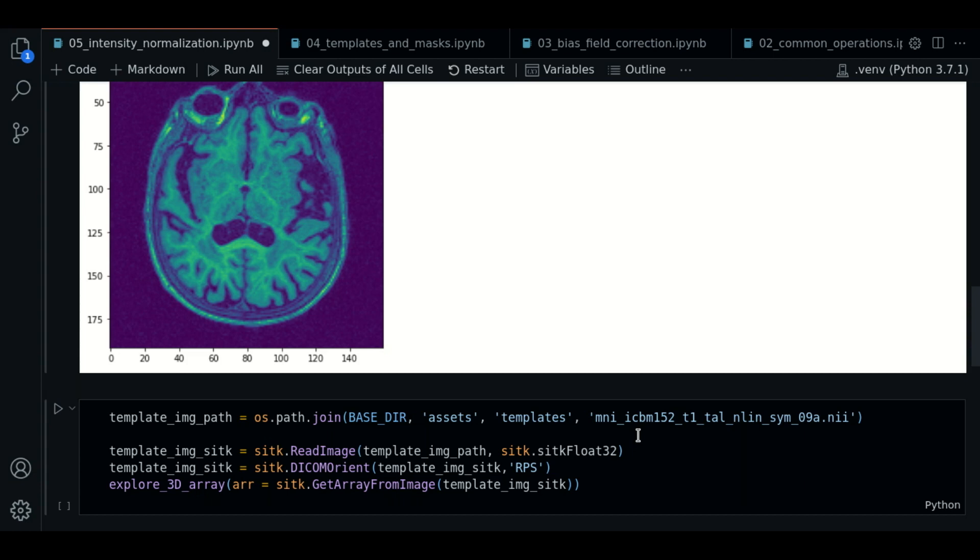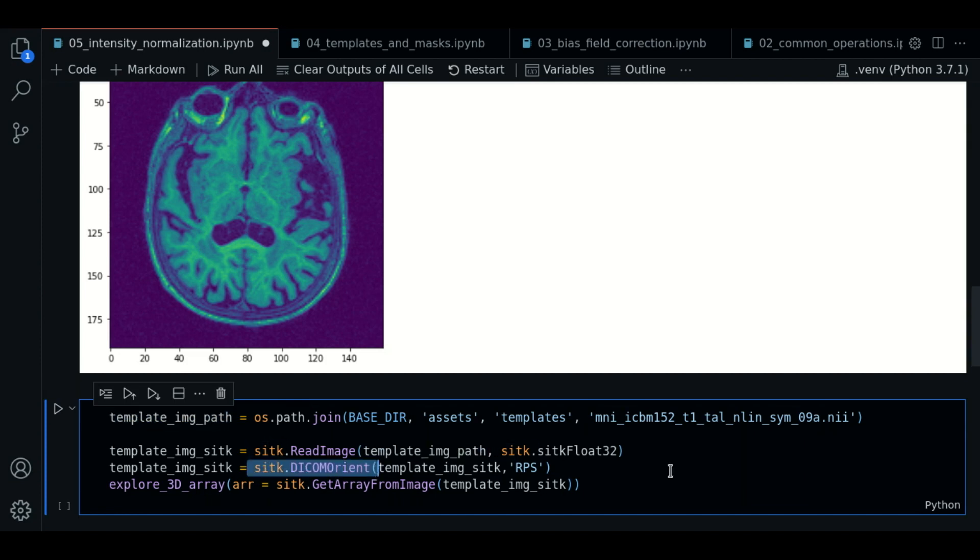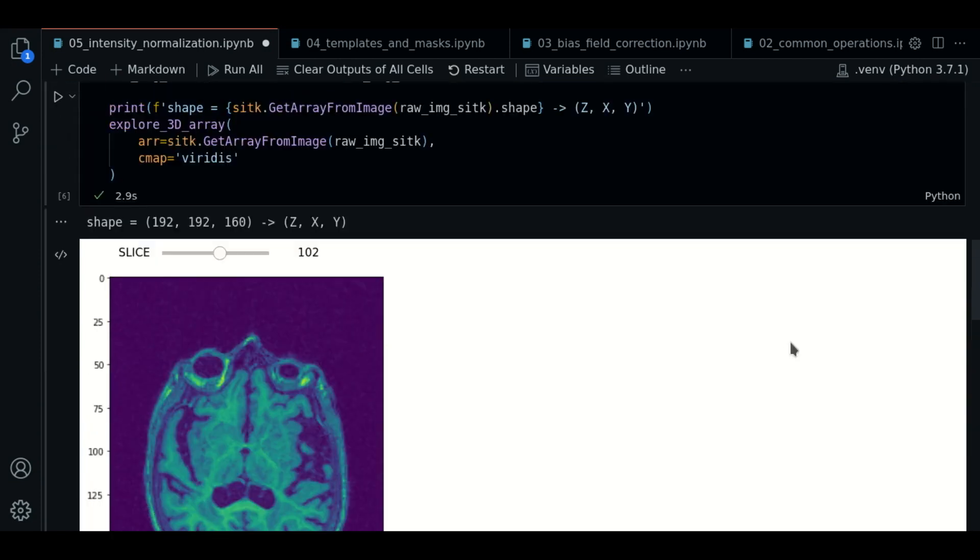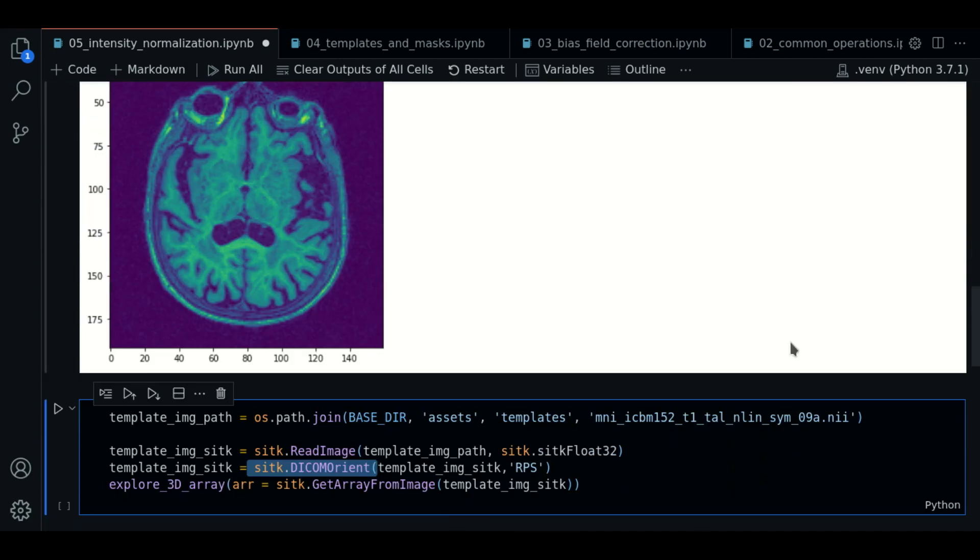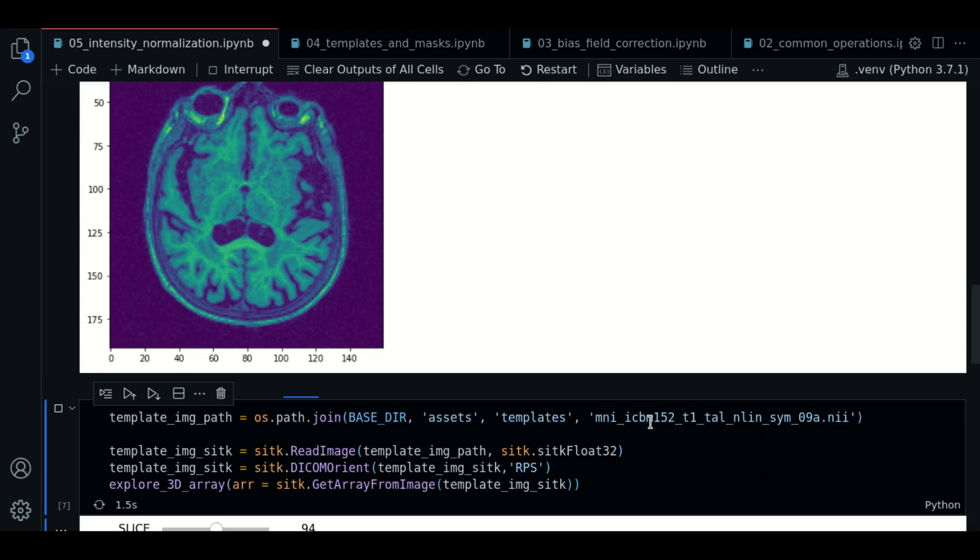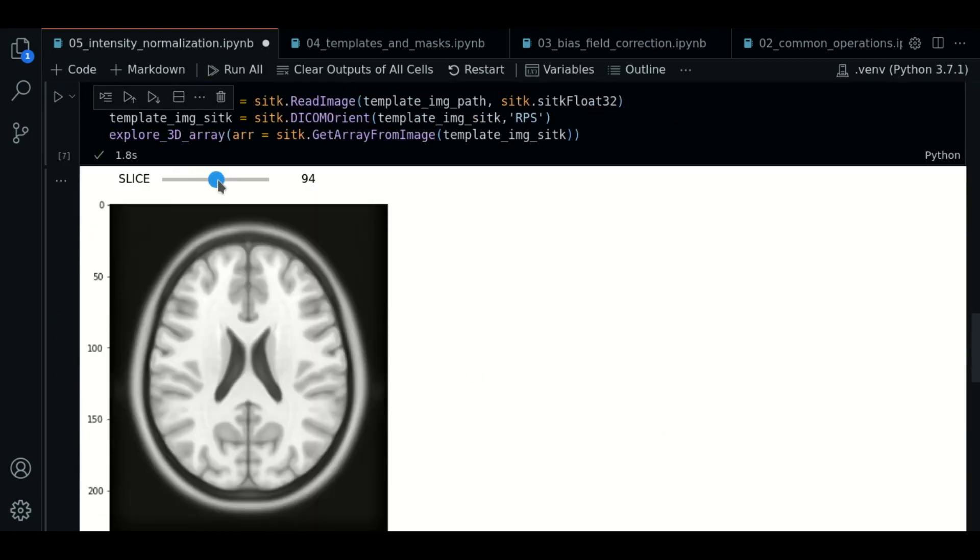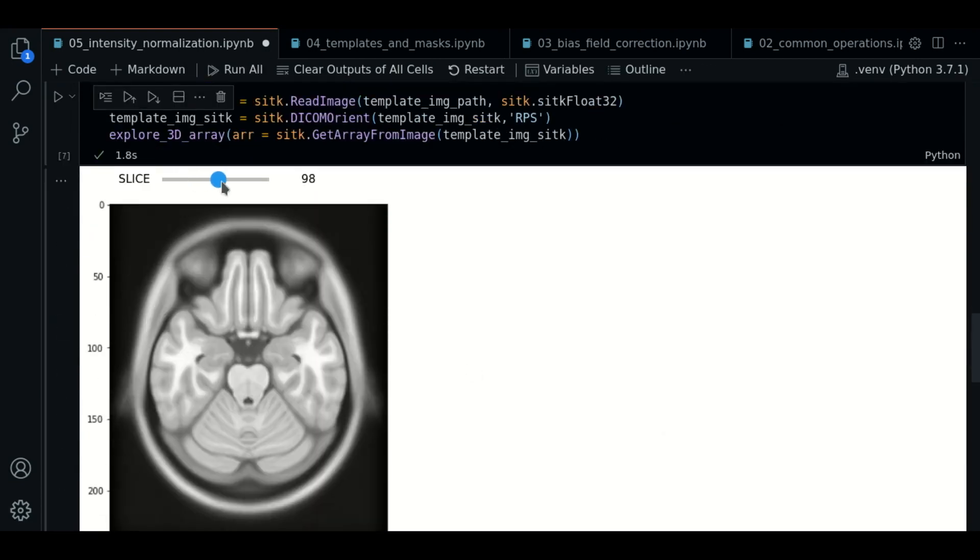So given that, we load the template. It is the same MNI 152 template we used in previous videos. So let's see.